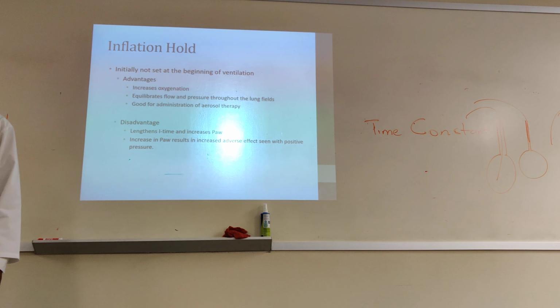If you have a patient that has atelectasis, it would be nice to institute inflation hold, because that will help stress the alveoli open. Okay? Any questions about inflation hold? So initially, you don't really need it, but if you get your patient on there and you feel like you need it, you can institute it. Okay?